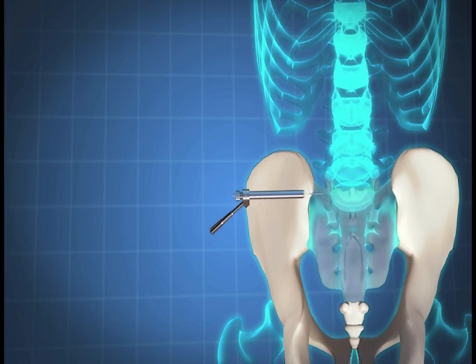Place the striker tube onto the drill guide. Using a mallet, tap the striker tube until the drill guide is secured to the ilium and no movement is identified. Remove the striker tube and pin sleeve from the drill guide. The appropriate Samba length is determined by sliding the drill gauge over the Steinman pin.